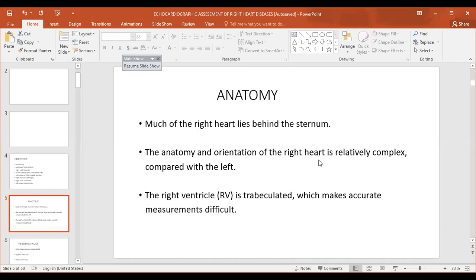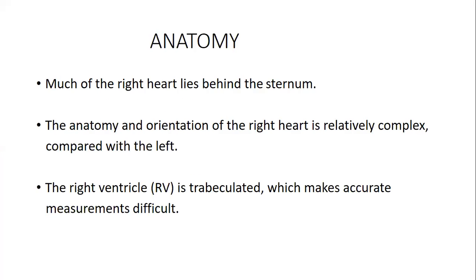When you look at the right side of the heart, for those of us who are practicing echo, you agree with me that traditionally, when you are doing a transthoracic echo, we normally don't assess so much the right side of the heart. And okay, I can now have my... You can see it on slideshow. Yes, I can go ahead.